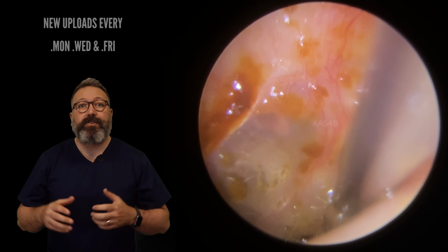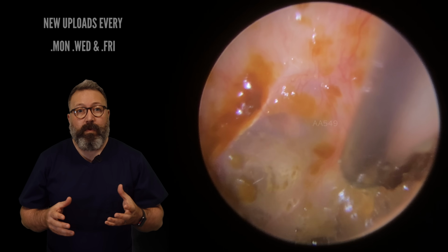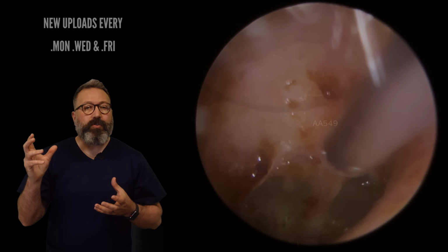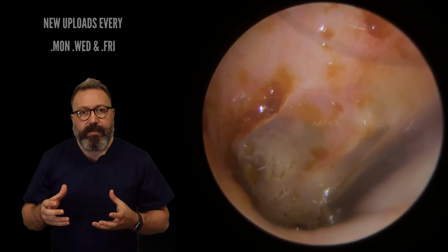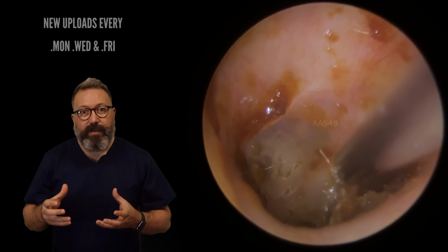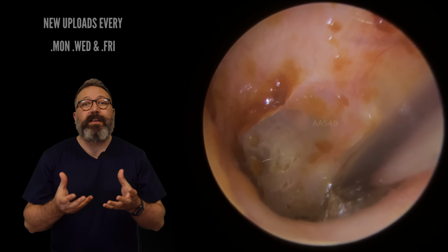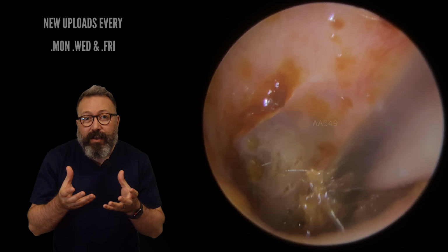Now, up until this point, the patient had felt they were hearing a little bit better. But when we started to remove this last section, the patient actually said, oh my goodness, that's so much better. They could hear a massive difference when this came away. So let's lift. There we go. You can see it's drawing these pieces of skin up. This is really painstaking work, because you've really got to be patient with this. Look how that's coming away.